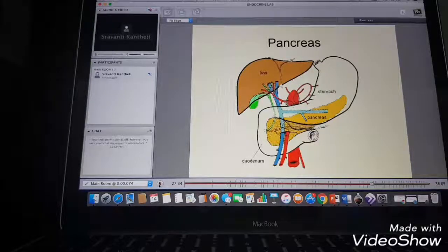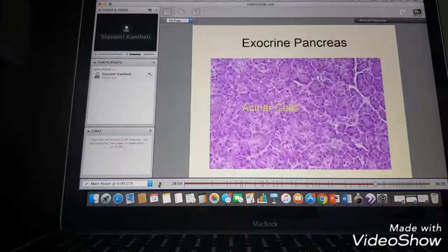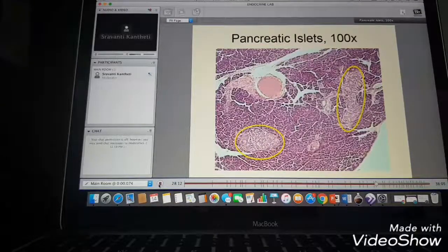What the pancreas actual function is mostly exocrine. Now we're talking about the endocrine gland, right? So a majority is exo, means that it has these ducts, because the pancreas is vital to digestion and it's part of the digestive process. However, we're not going to talk about that. We're only concerned about the endocrine part. So on histology, you see these vessels? These are all the ducts as part of the pancreas digestive function or exocrine function. So I'm going to skip this exocrine pancreas because we don't care. We're in the endocrine system.